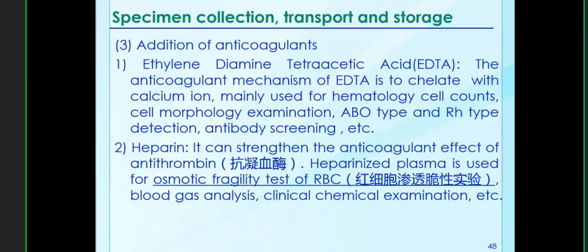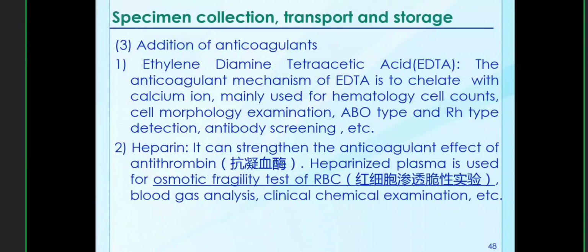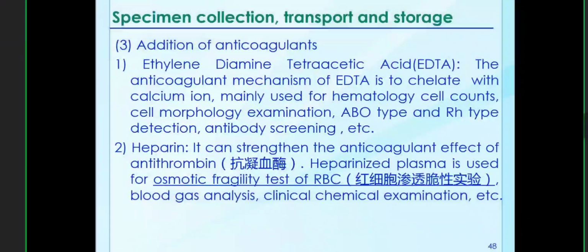This slide is for the anticoagulants. Next, I will demonstrate some anticoagulants for you. First one is EDTA, the abbreviation for ethylene diamine tetraacetic acid.